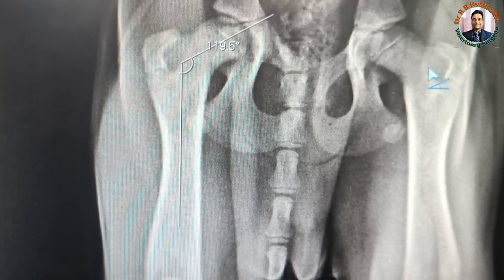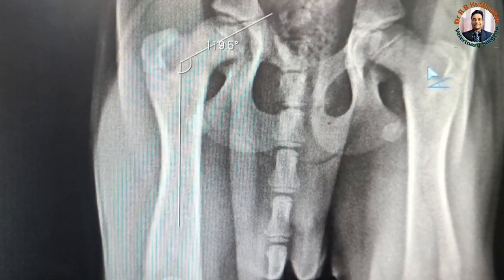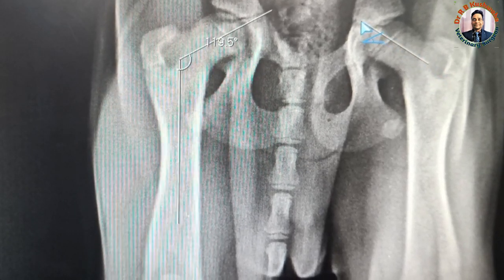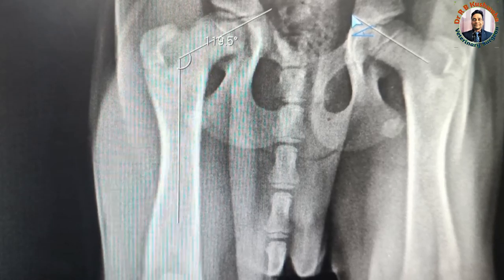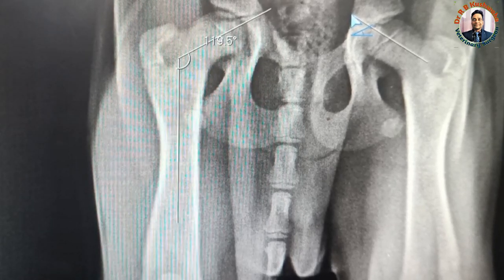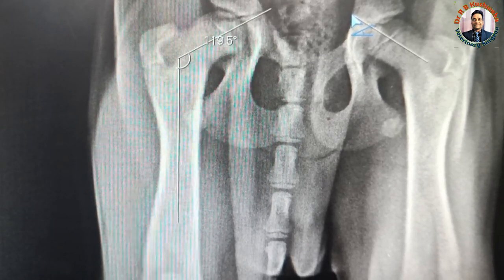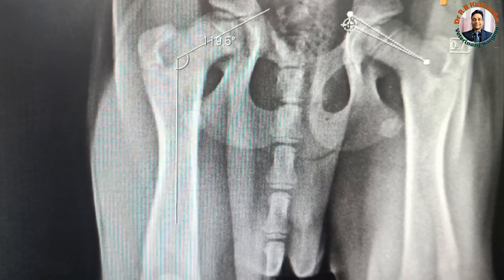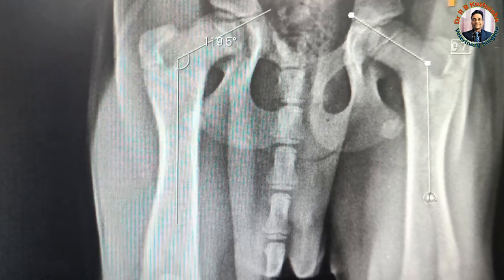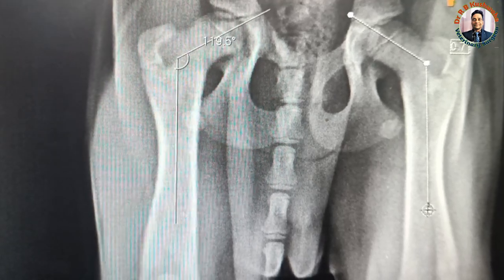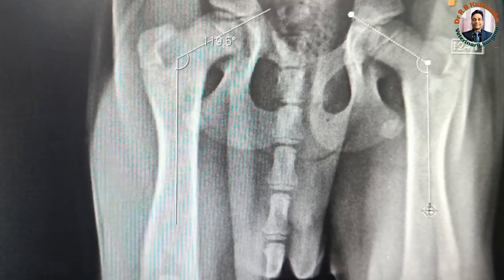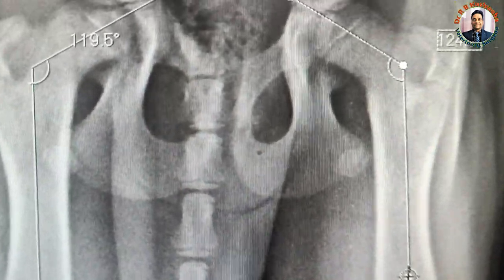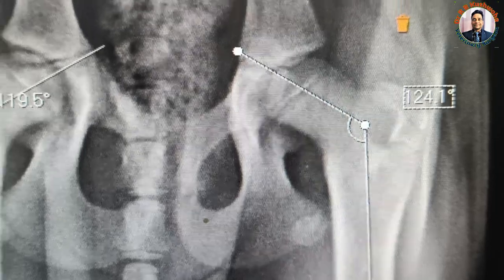Now we calculate the femoral head neck shaft angle in the left bone. Here we bisect the femoral head and neck, and then bisect the shaft of the femur. This angle is 124 degrees.